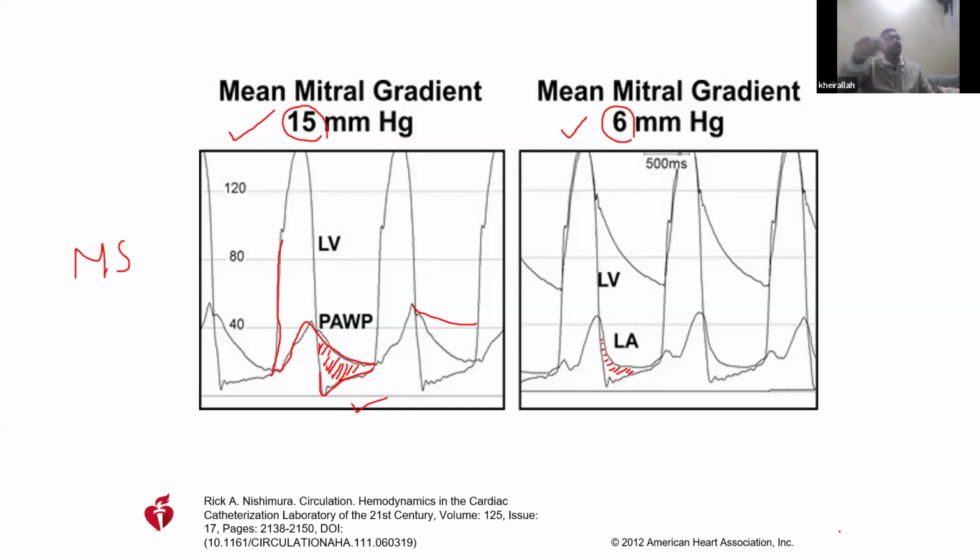Exactly, exactly. That's what we have discussed earlier. The wedge pressure is late. So what we are measuring here is actually non-physiological.